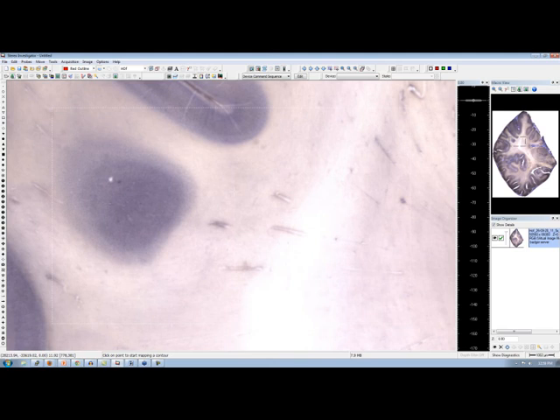And if I wanted various users to do stereology on distinct regions of anatomy, aside from using Biolucida Viewer to share the image from the Biolucida Cloud, I would have to make copies of this image and put them on each of the workstations so that each user could work on it simultaneously. Exactly. And you can have multiple users working on this at the same time. Right, which I think is a very powerful aspect of cloud-based image sharing. Yep, and this integration is the same in Neurolucida and Microlucida. Everything you can do, you'll see it here. And we're trying to make it seamless.